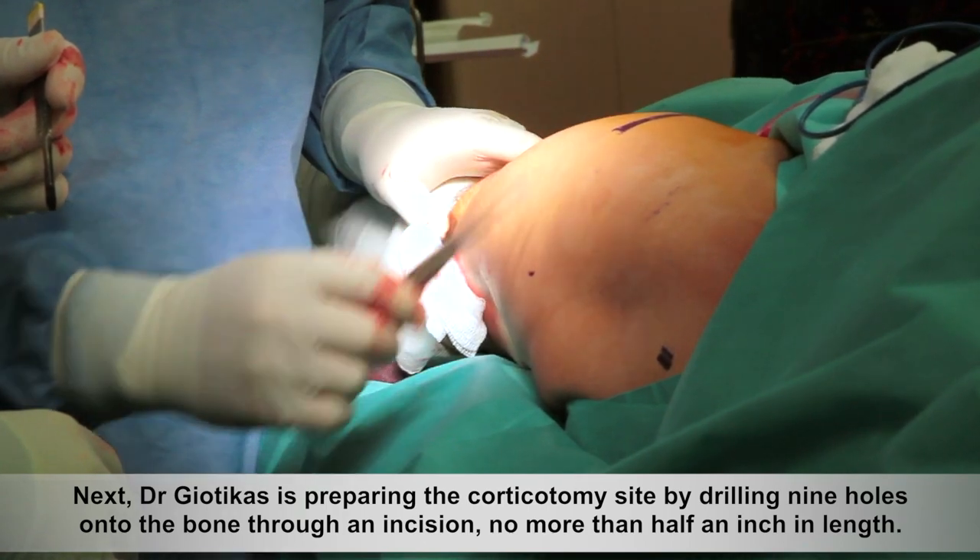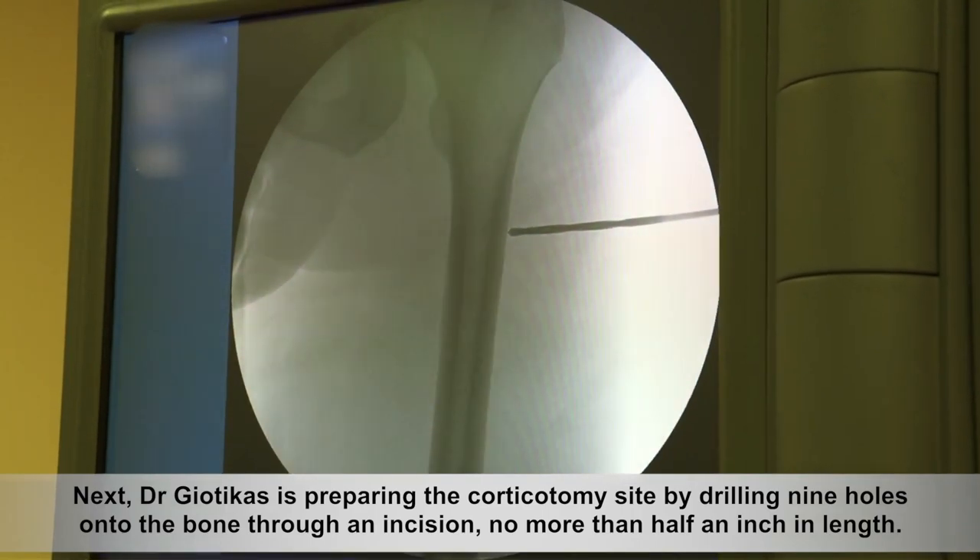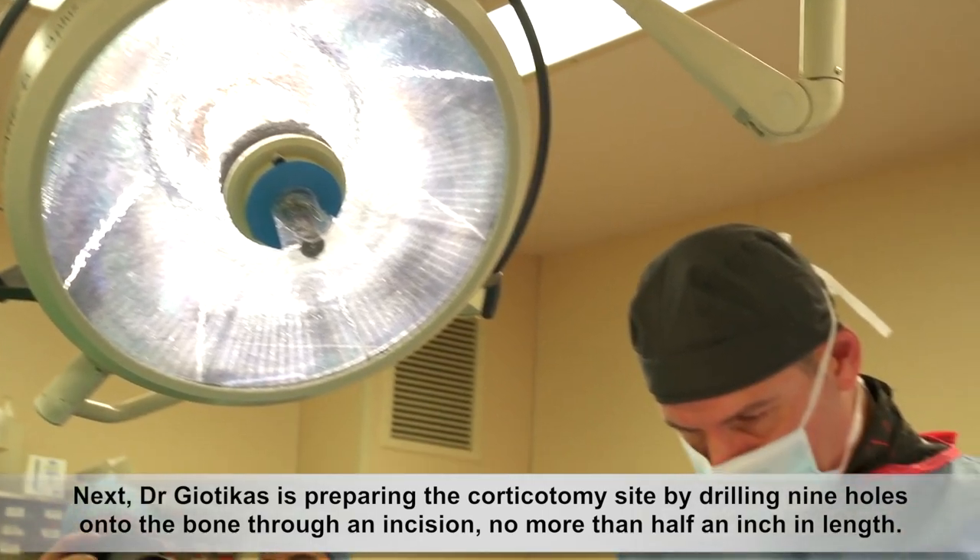Next, Dr. Geotekas is preparing the corticotomy site by drilling nine holes onto the bone through an incision no more than half an inch in length.